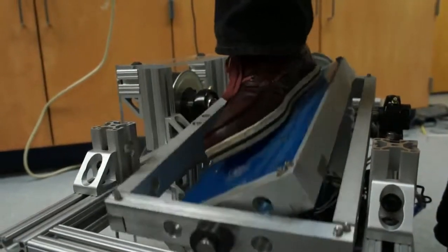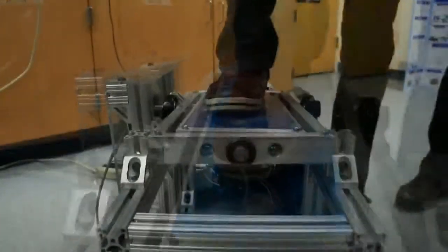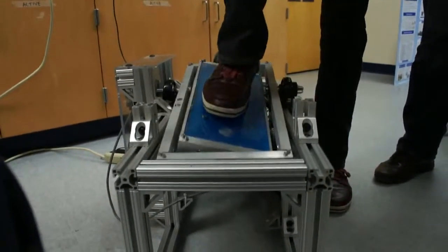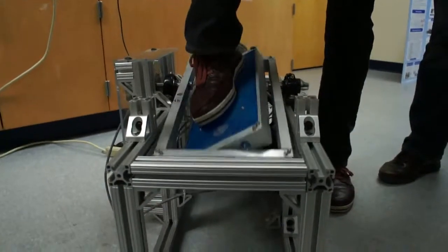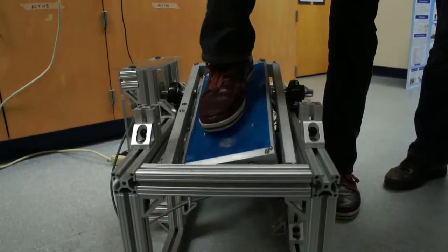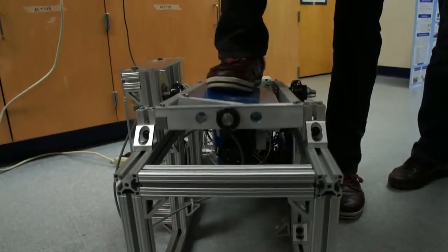A patient's progress can be tracked by how well they're doing in the game. Whether it's a more acute patient that has a minor ankle sprain, the virtual reality will increase the adherence to a training program because it makes the training program a lot more fun, a lot more enjoyable for them. They'll look forward to doing it because it's not just a simple mundane exercise that they really don't want to do.